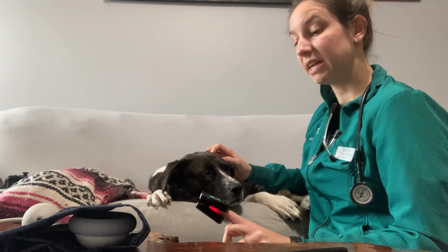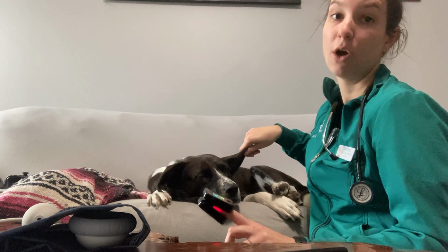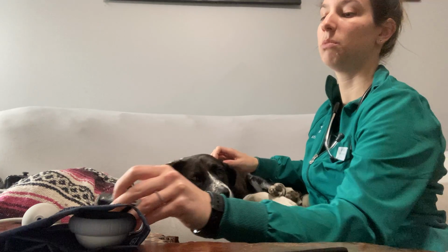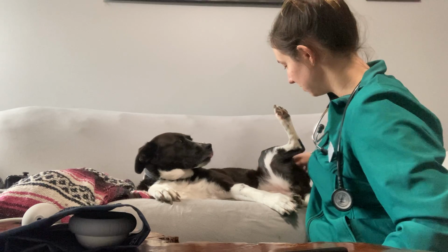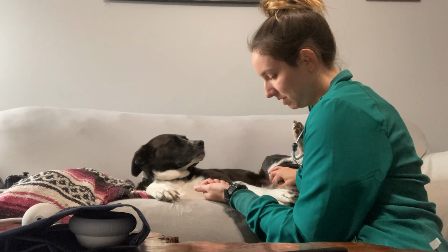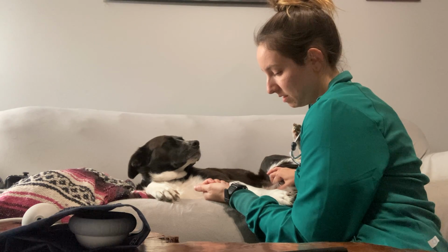I am currently reading 99%, that is within the 95 to 100, and my pulse rate is 69 beats per minute. When it comes to pulses, we're looking for a pulse between 60 and 100 for the average human adult. Dog pulses tend to run a little bit higher, as do their respiratory rates. For Sadie, hi baby girl, we can take her pulse manually. Find that nice femoral. Yes, you do so good, baby. And I am counting for 15 seconds.